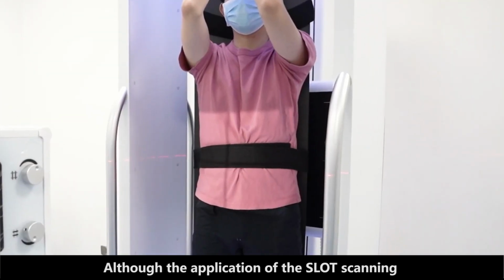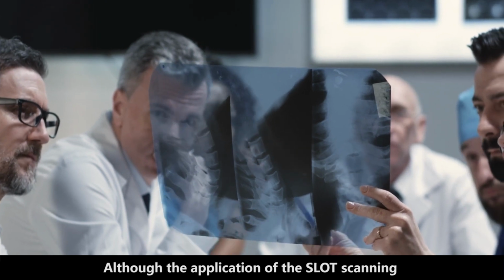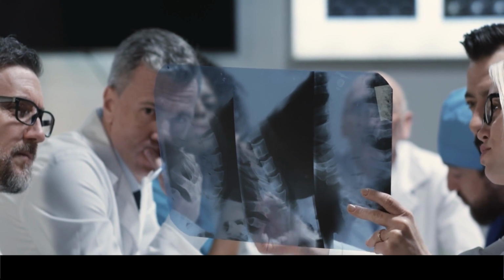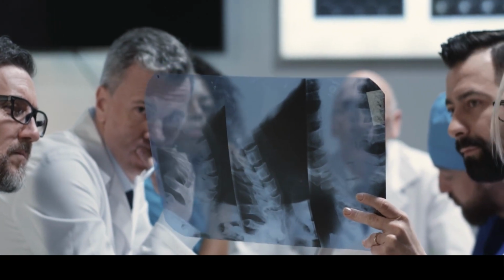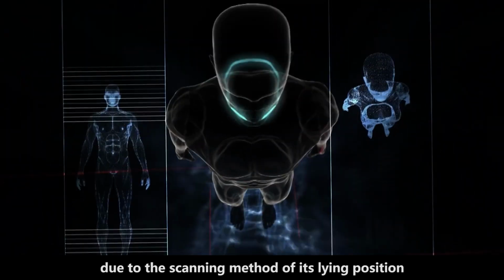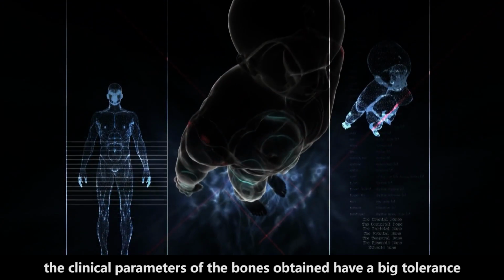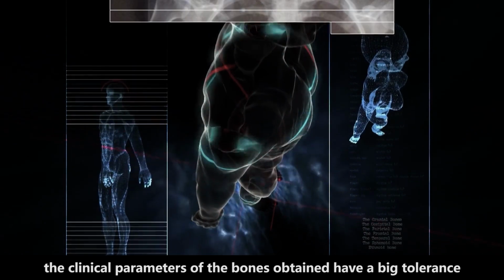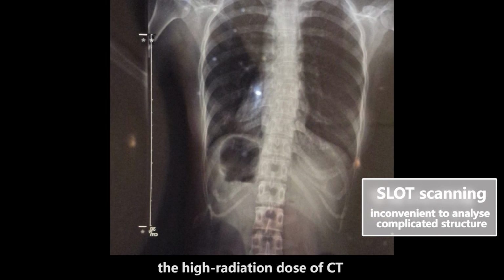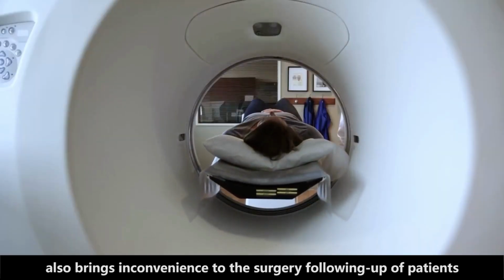Although the application of slot scanning in current digital radiography devices ensures one-time imaging of the whole spine and the lower limbs, the image resolution is not ideal. Although CT bone imaging has the strongest resolution, due to its lying-position scanning method, the clinical parameters of the bones obtained have a big tolerance compared with the weight-bearing position. In addition, the high radiation dose of CT also brings inconvenience to the surgery follow-up of patients.